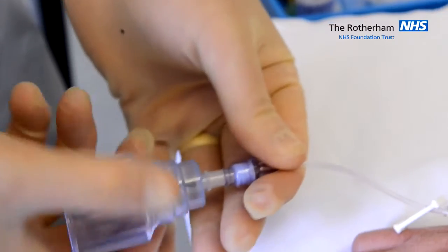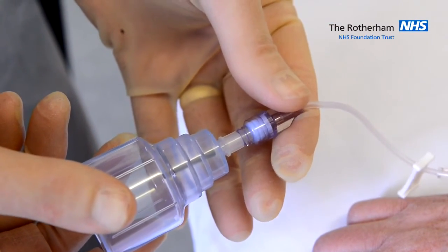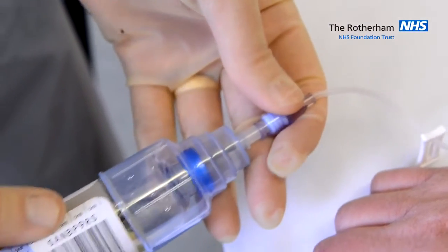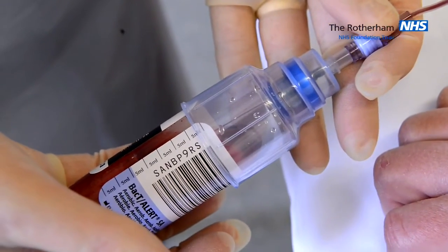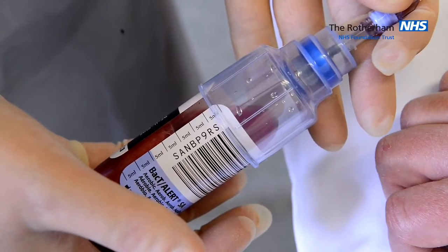Join the adapter and the needle free device together and obtain your blood culture with 5-10 ml of blood, using the blue blood culture bottle first.